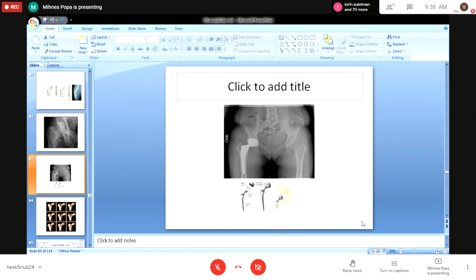The arthroplasties are not all of them total. We can have the hemiarthroplasty with the Moore hemiarthroplasty, or the Thompson one. The Moore is uncemented and Thompson is cemented. Hemiarthroplasty means that we only make an osteotomy of the neck, we take out the head of the femur, and then we put there the prosthesis that is just in this part. We do not change the acetabulum.